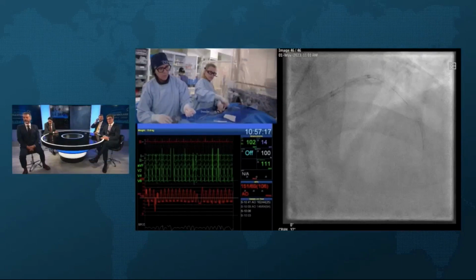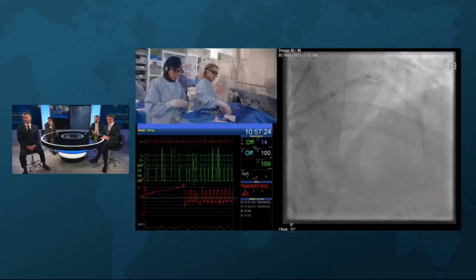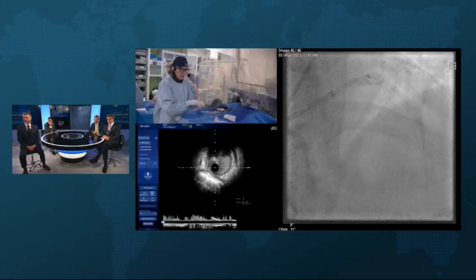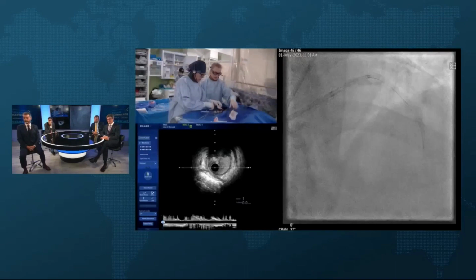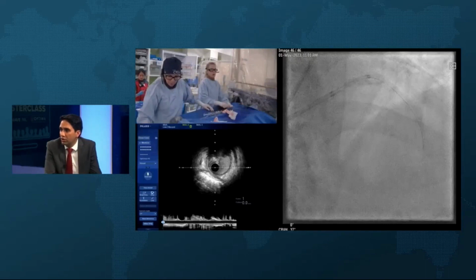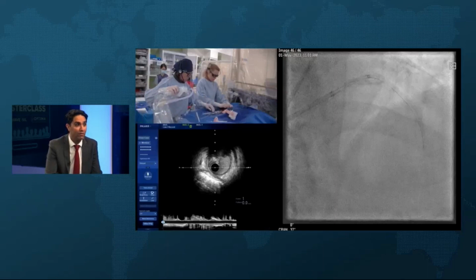The only thing I would say is that your NC balloons are significantly undersized proximally. Yes, that's what Claudia made the point of. Just have a look with the IVUS, and then we may need a bigger one, especially for the ostium of the LAD. Definitely. But I'm not sure you need that now. You've definitely cracked it. The wire's in the middle of the balloon. I think you could probably stent here and then use a post balloon to size by MLD max of this, or IVUS or whatever.